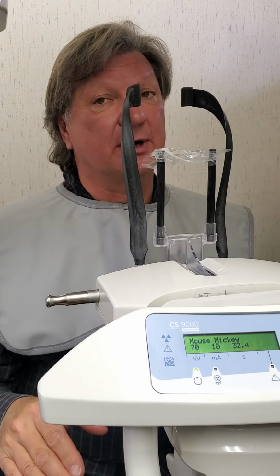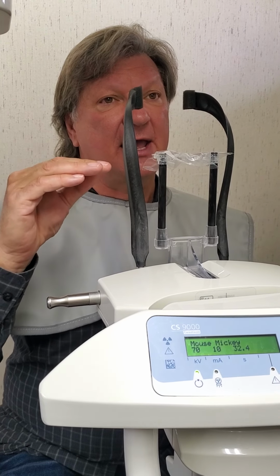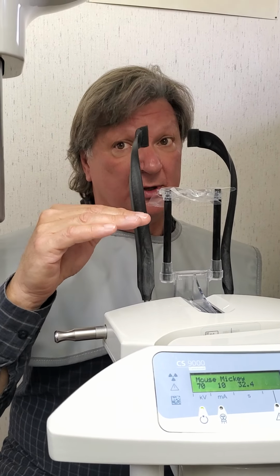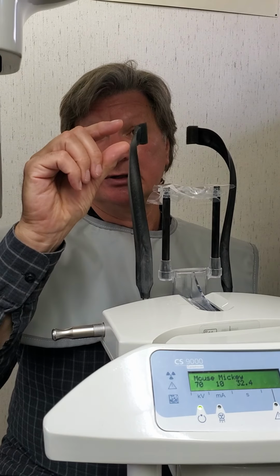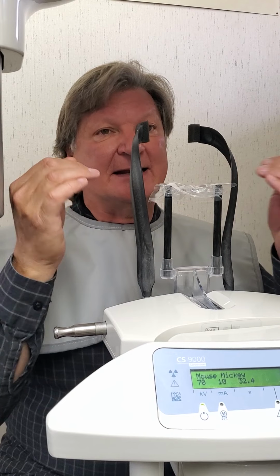What are you trying to capture on this X-ray? The root tips have to be on there, and the crowns all have to be on there. They can't be cut off at the cusp. You know that you have to have darkness under all of the crown cusp tips. Okay, doesn't have to be much, a couple millimeters, but all of the tooth has to be in on that X-ray.